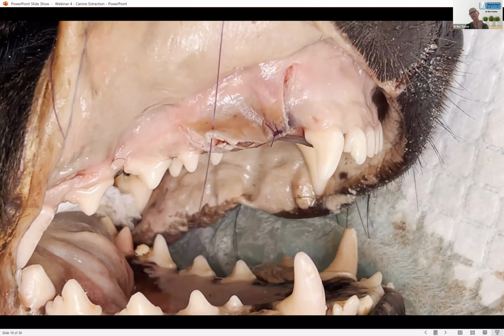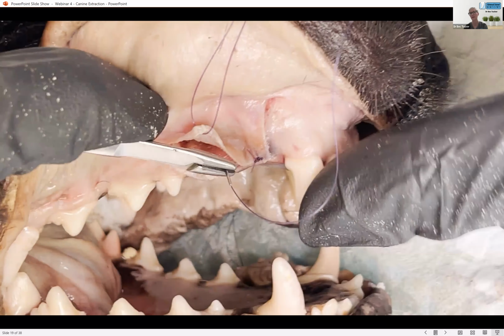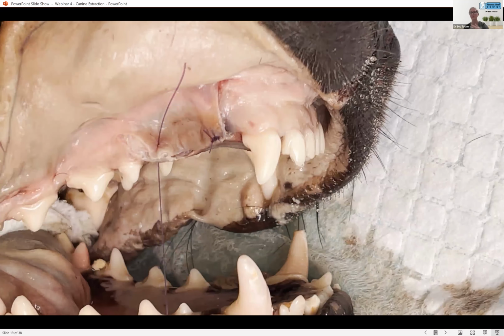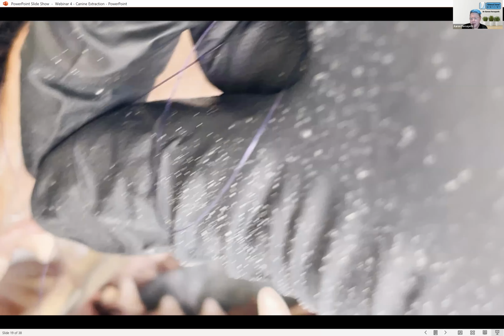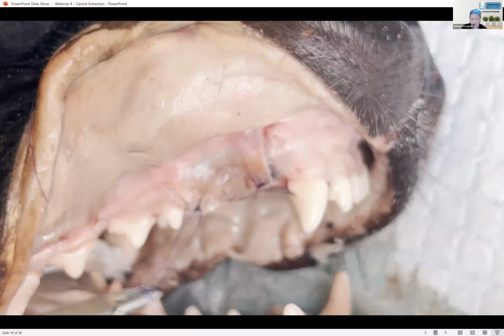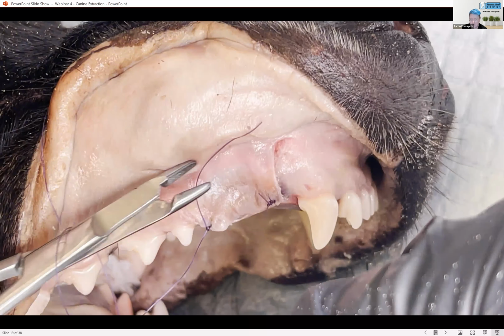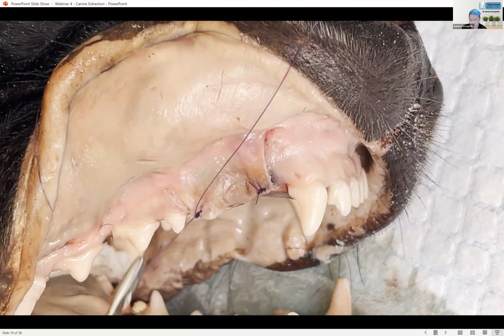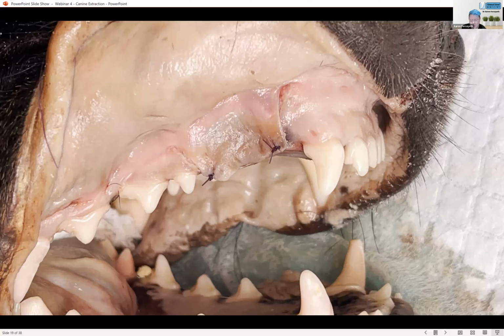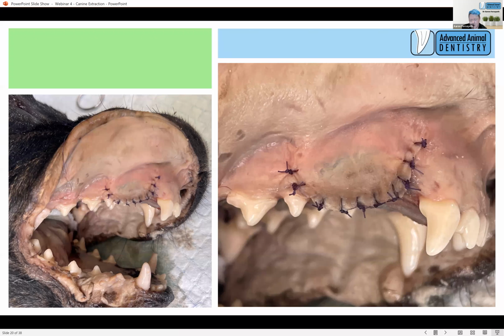The other important thing is, I guess, suture from the flap side first. You want to go from the flap and then into your attached tissue. Don't try and go through both in one hit. Do 2 passes. If anyone's ever worked with us, we do get lazy, and I will try and do a pass and think, oh, I've saved so much time. When it works, it's great, but when it's not, you're putting some really bad forces on your flap, and you again are potentially going to tear it. They're pretty tough, but they also rip easily. So you do have to be careful, especially in cats. Okay, so we've got the two main sutures there opposing that flap.